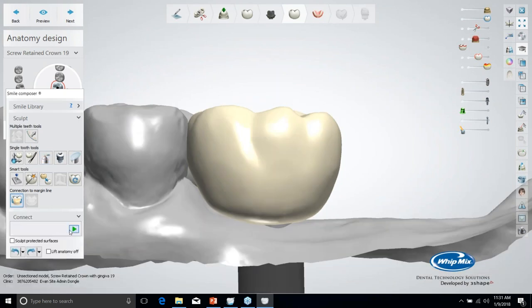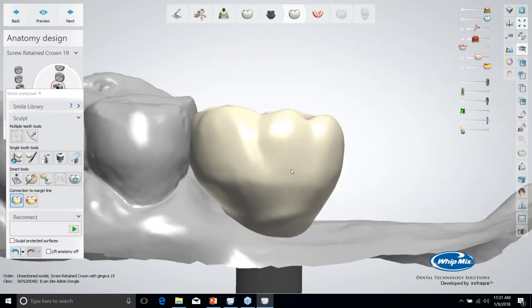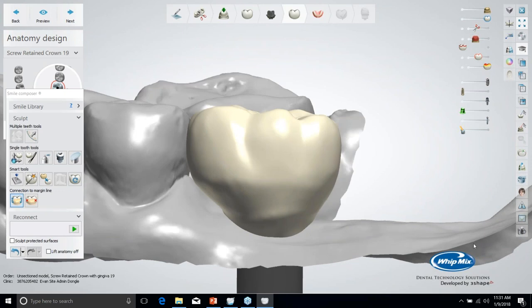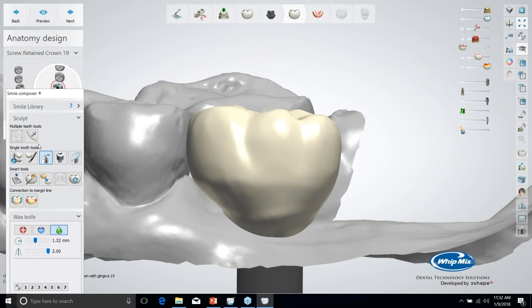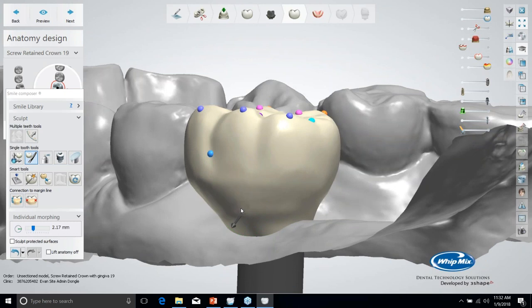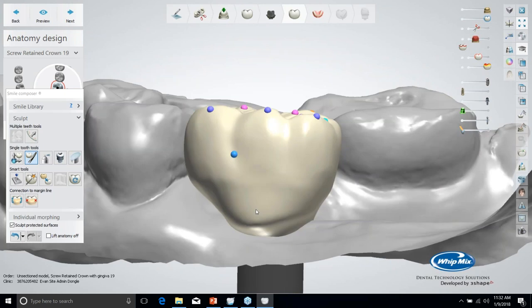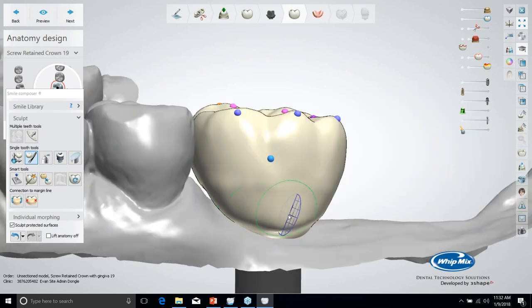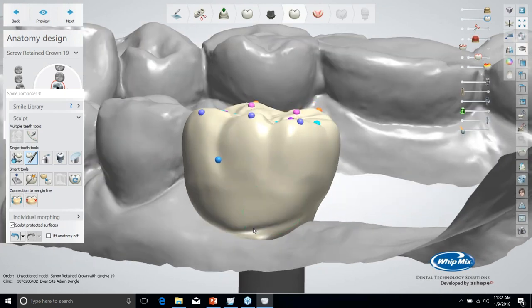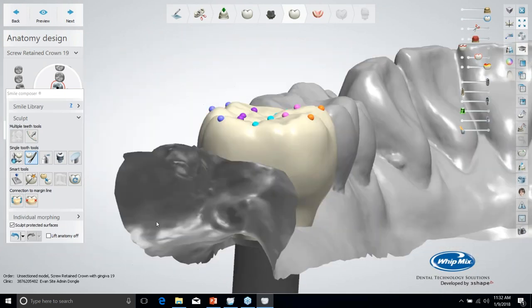So now I can go ahead and connect this to the margin, which will essentially be that interface. Now you will see it just did something where it auto-sculpted this area, so I am going to have to re-sculpt this unit. So I'll go ahead and get the morphing tool, and we're going to start bringing this back out, and I'm going to have to check on sculpt on protected surfaces so that I can adjust that contour, because we want the tooth to look natural, where if we had filled that area in with tissue now, it wouldn't look good. So morph that back out.